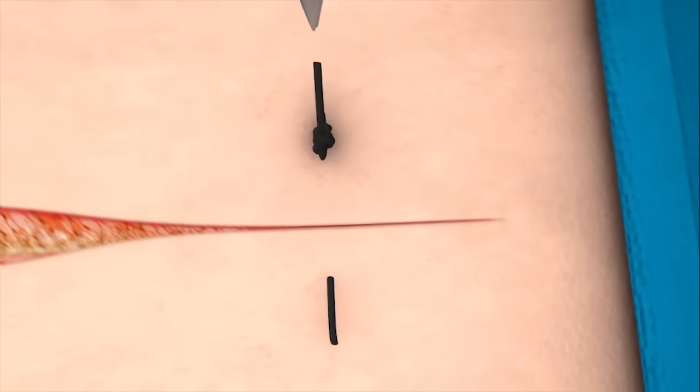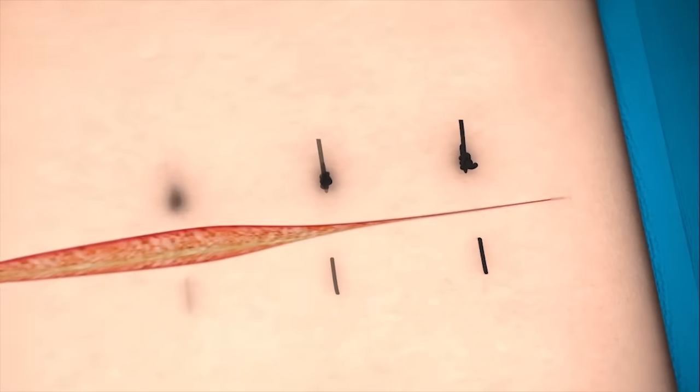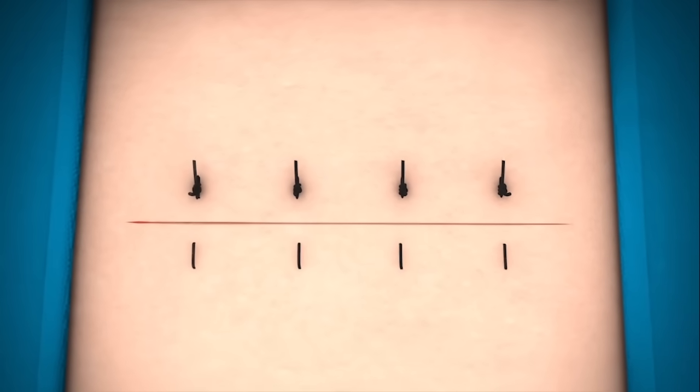Trim the ends and then continue with equally spaced vertical mattress sutures until the wound is closed.